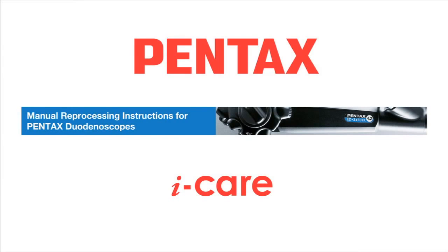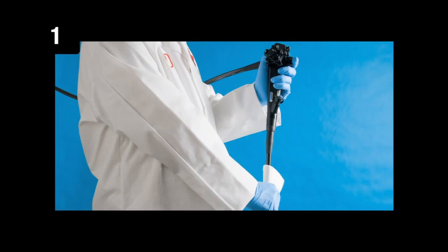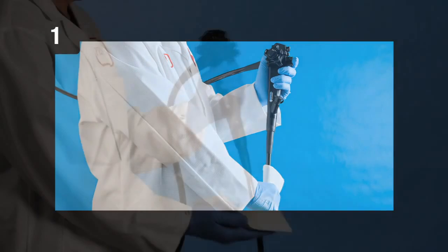Manual reprocessing instructions for PENTAX Video-Duodenoscopes. Step 1. Wipe the insertion tube.